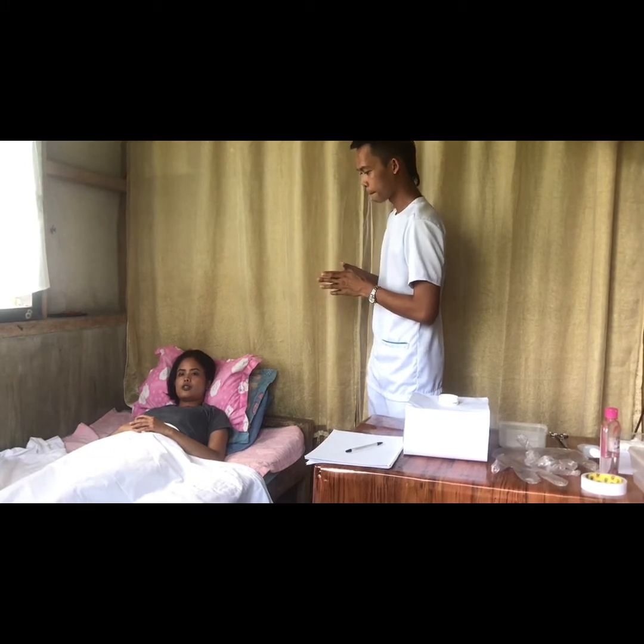Last night. Okay. I am here, ma'am, because there is a medical order for me to perform catheterization on you in order to control urinary incontinence. Is that okay with you? Yes. Okay. Do you have any questions about catheterization? It is hard. Ma'am, it is quite difficult, but all you have to do is cooperate with me to make the flow of the procedure easier. I am here to assist you. I am here to help you, okay? Do not worry about the procedure itself, okay?